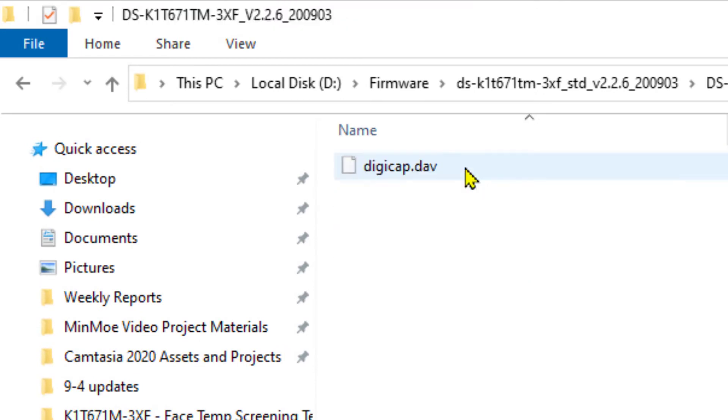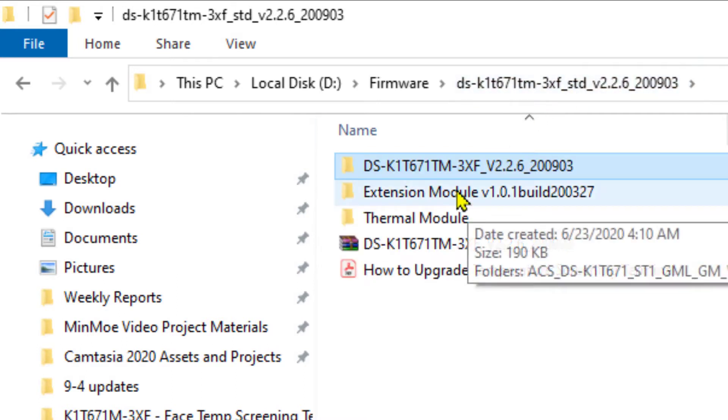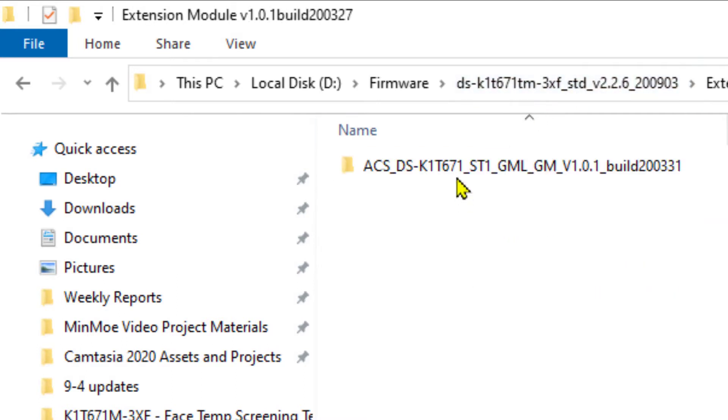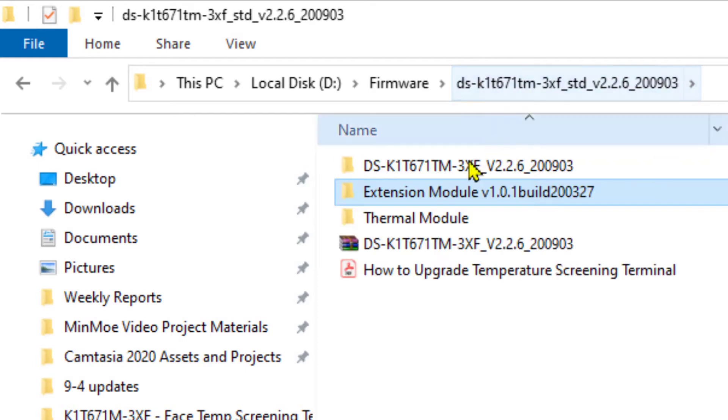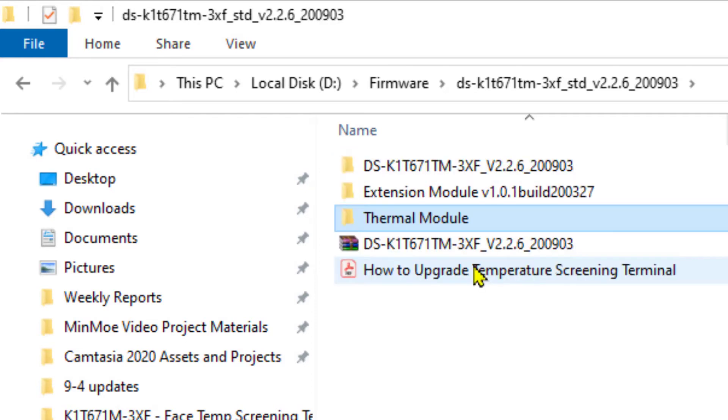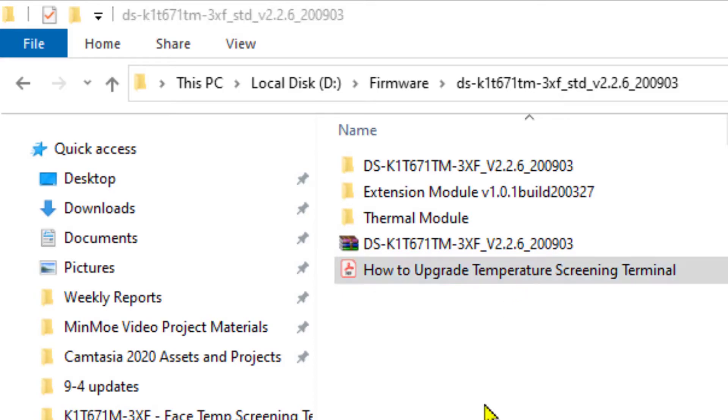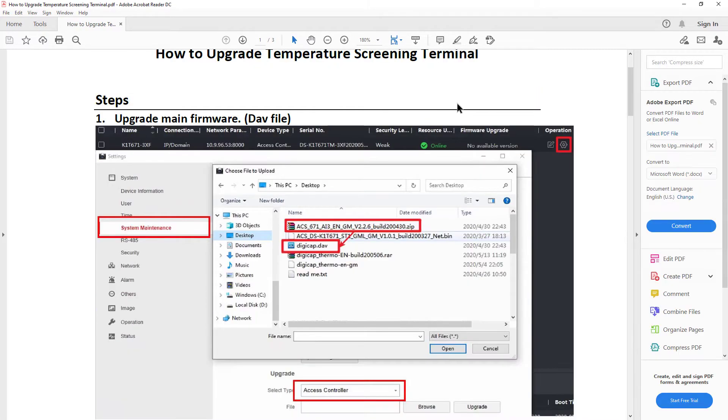Inside each of these folders is the actual firmware file that I'm going to need, whether it be for the extension module or the access control module or for the thermal module. There's also a document called How to Upgrade Temperature Screening Terminal, and if you were to open that document up, you'll see that there is an order in which these should be done.